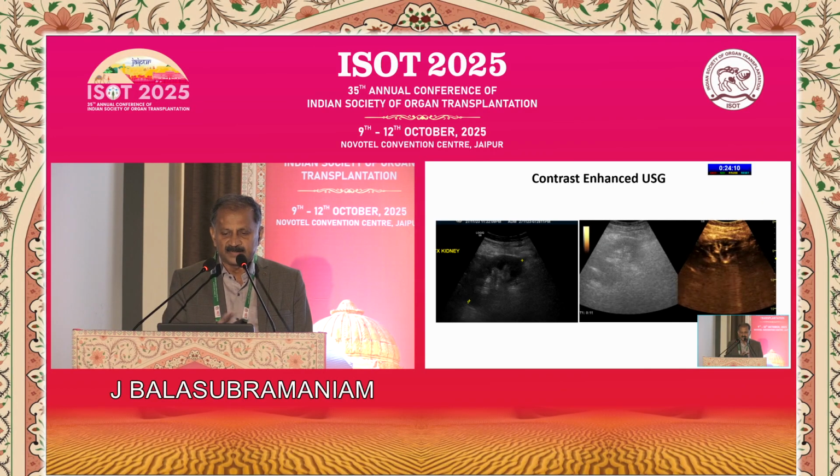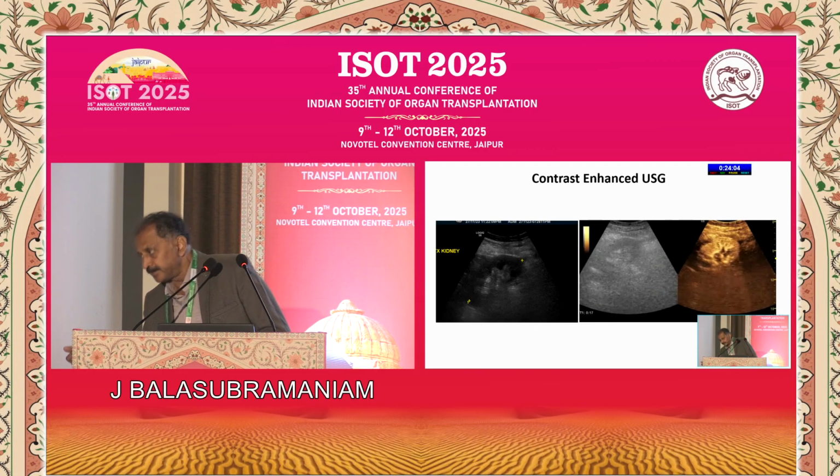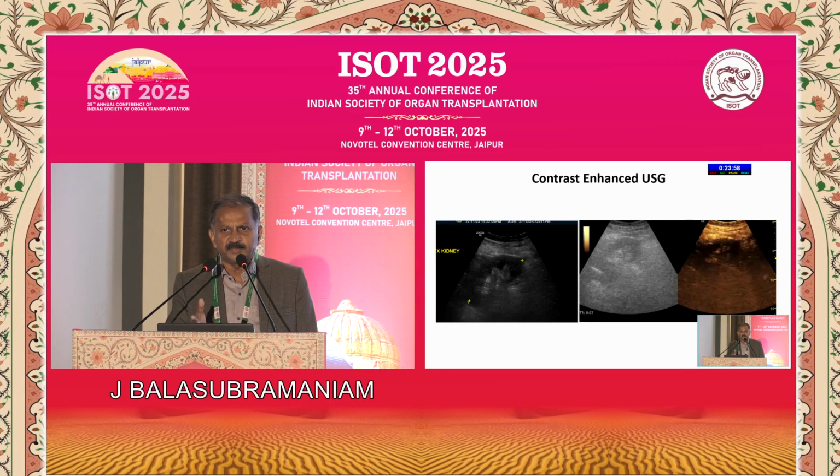So this is a sample. This is an ordinary contrast enhanced ultrasound. Do you have a pointer? Pointer. So once you see this doing it yourself, you'll be thrilled and you'll be hooked on.